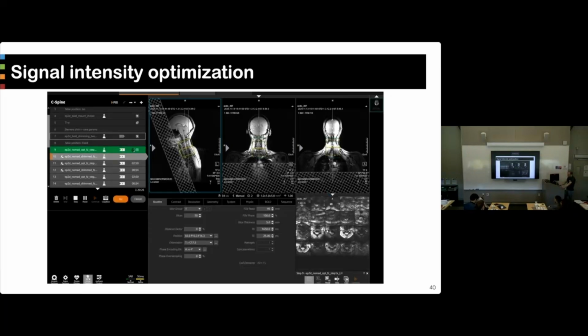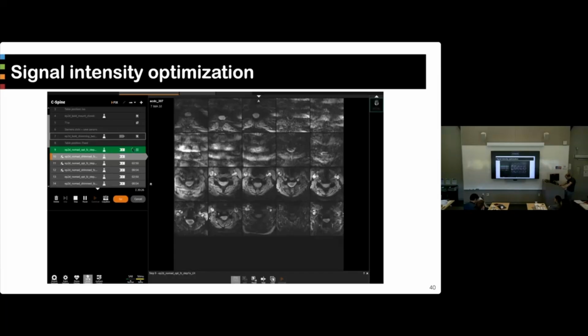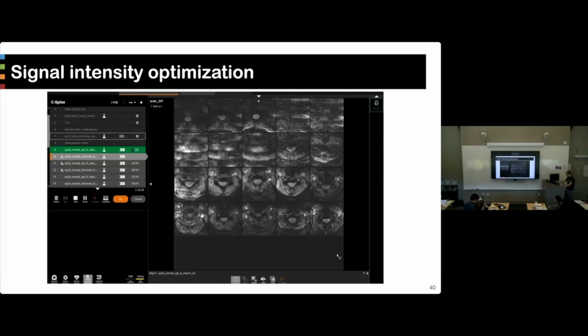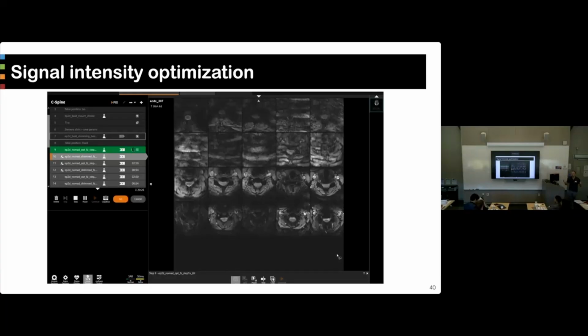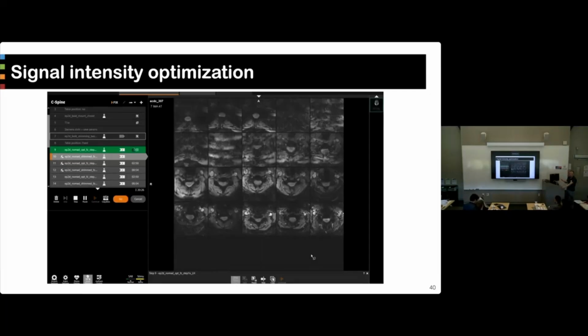And you can see it here at the bottom. I don't know if I can stop it. I don't see that I can stop it, but that's totally fine. Point is, you can see it changing, and those images look terrible. Why is that? Well, most of the images you're going to see when you optimize are not good. So that's what we're seeing. Just in real time, it's trying to go from something that's bad to something that's better. Yeah, and it's working.